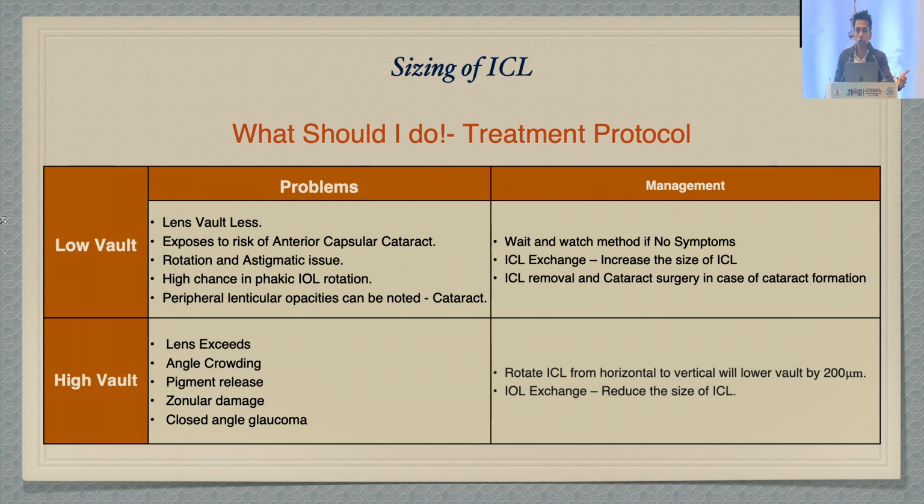The sizing, what should I do? What should the treatment be in any case? If you have a low vault, wait and watch if there are no symptoms. Guys, that's the general rule. If there are no symptoms of the patient, just wait and watch. It should be fine over a period of time.